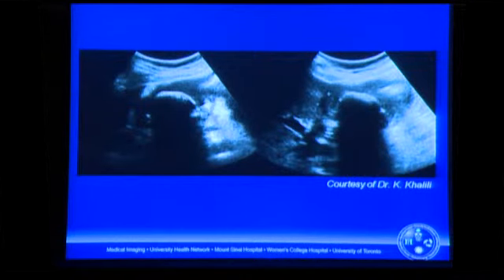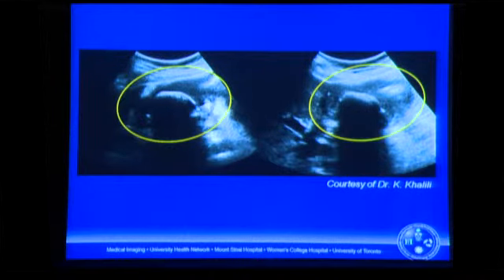Now this was an elderly woman. She was an inpatient in our hospital and she was brought down with acute right upper quadrant pain. She was on a medical floor and she was in hospital for a different reason. This is the best image we could get of the gallbladder fossa, and it demonstrates a large gallstone surrounded by some isoechoic material. And the question arose, well, what was going on? So the one great advantage of ultrasound is you get to see the patient, you get to talk to them, you can read the chart.